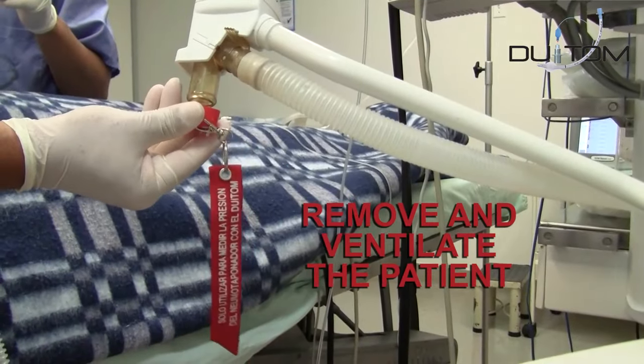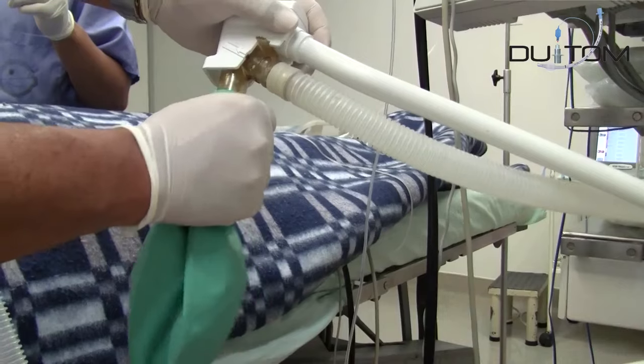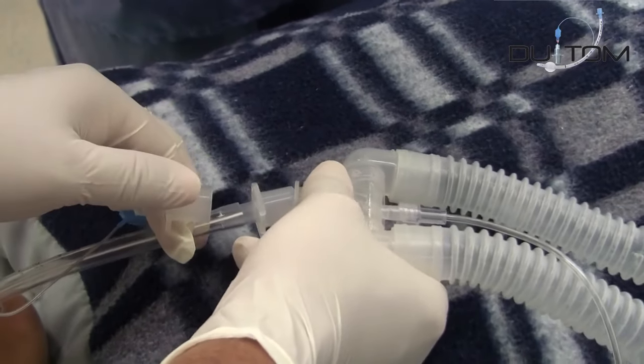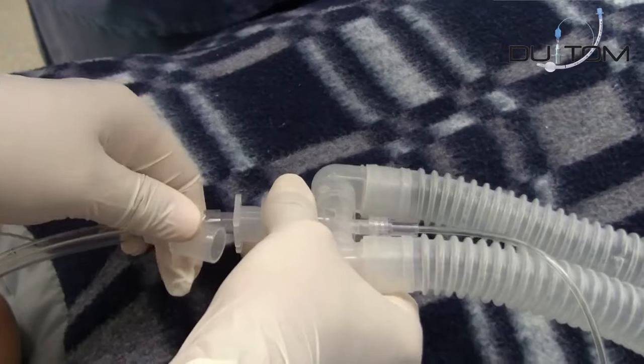Remove the red universal plug and connect the breathing bag again to the machine. Connect the anesthesia breathing system to the endotracheal tube and continue with the anesthetic procedure as you prefer, with manual or automatic ventilation.